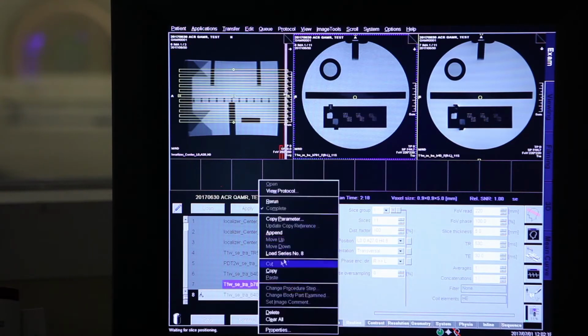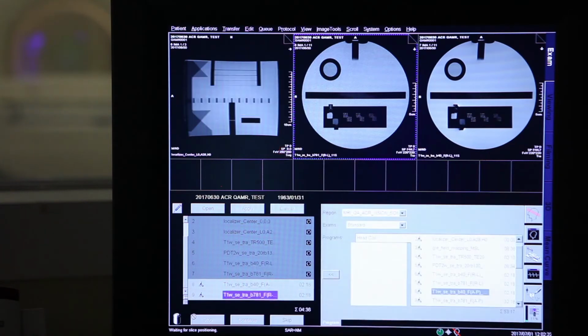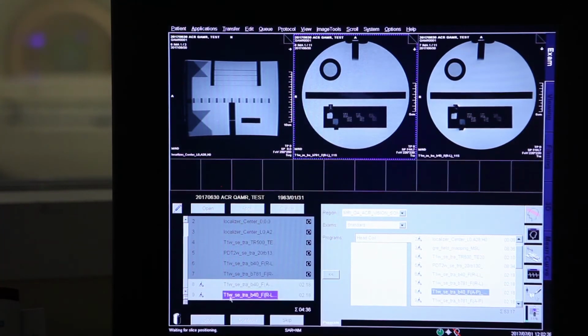Now we localize the frequency in the AP. Now you're going to see the difference. These two structures we're going to shift the other way, in the y-axis, always in the frequency direction. So be aware of what's happening.